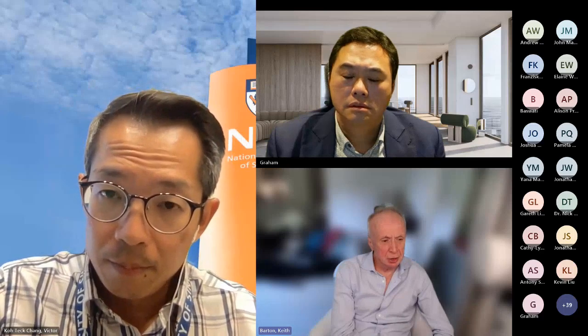sulcus is any less. The other thing I would say about sulcus is it's a shorter external course. So therefore, you'd think it would erode less, which is perfectly reasonable. Yeah, I mean, if I get a multiple erosion, I'll put it in the sulcus. Or it's just by being further away from the limbus, you know, more coverage. No, that's perfectly reasonable. Yeah, your shorter external course is going to be better.